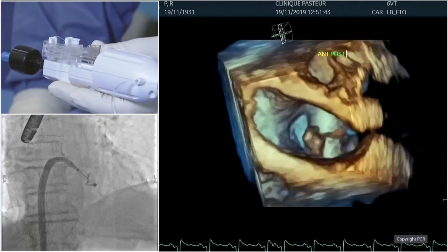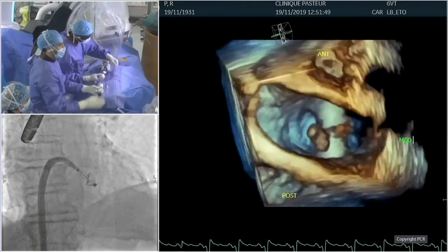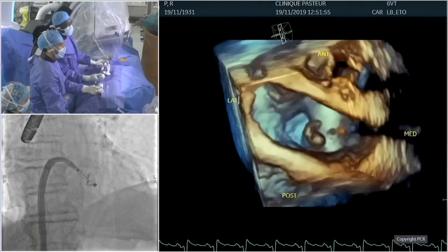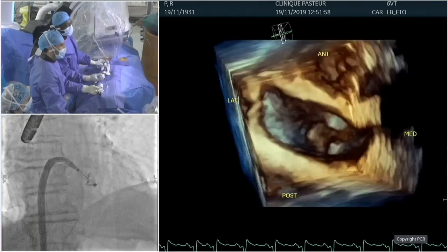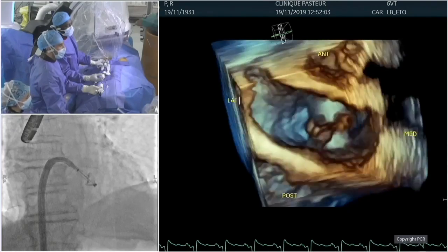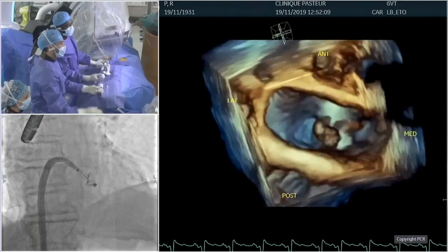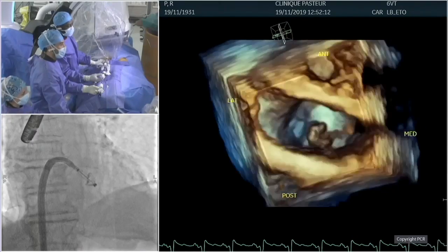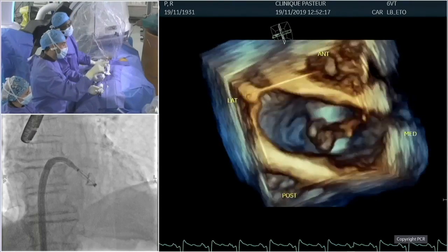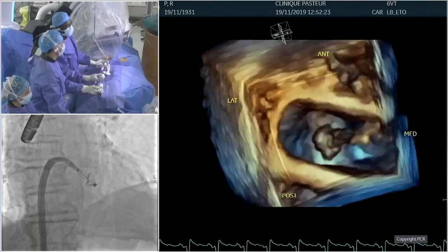Okay, again. Maybe Laurent will put some labels on the 3D view while we are explaining, but mainly, you have here, perfect, you see the anterior. It's a surgical view of a mitral valve. So you have on the top of the image the aorta and the anterior mitral valve. On the bottom, the posterior mitral valve. On the left of the image, the lateral part of the valve, and on the right, the medial part. And at the bottom, what we see is the PASCAL device just above the mitral valve. And just after the PASCAL device, it's a little bit hard to see, but we see the coaptation line of the mitral valve.